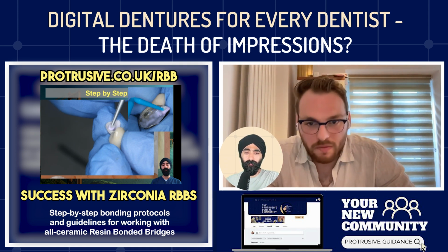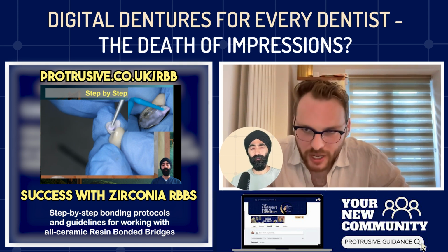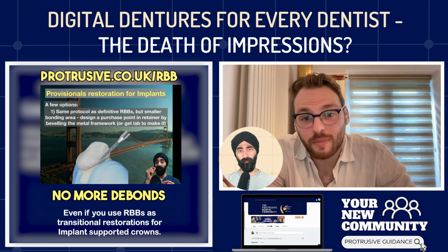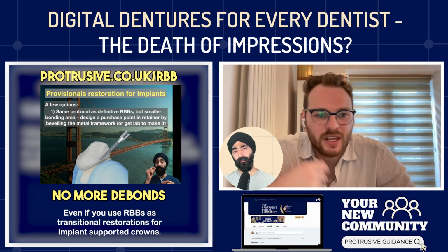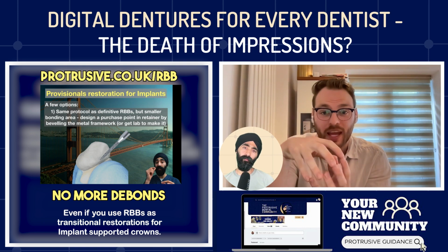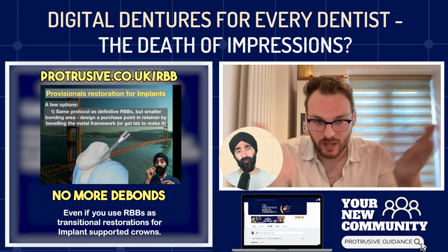I do that anyway for my consultation, great for communication, either with the patient or with Dean. So a lot of the time, and it's another beauty of it, in that consultation, non-invasive thing, take a quick scan. I can send that to Dean. He can then print it off. We can have models together and we can chat about the case, etc., and plan it.